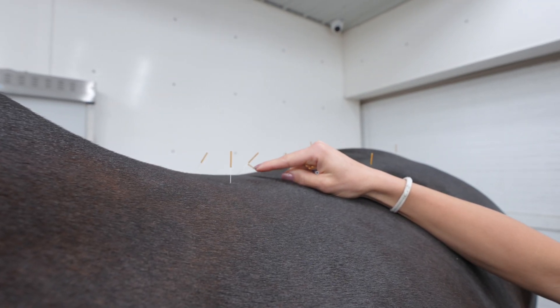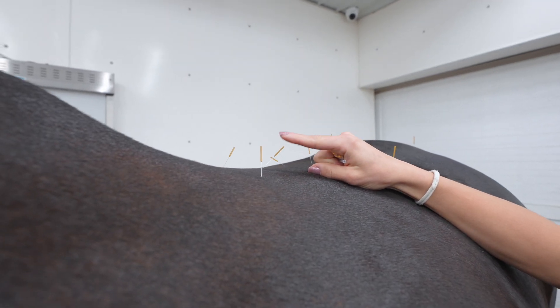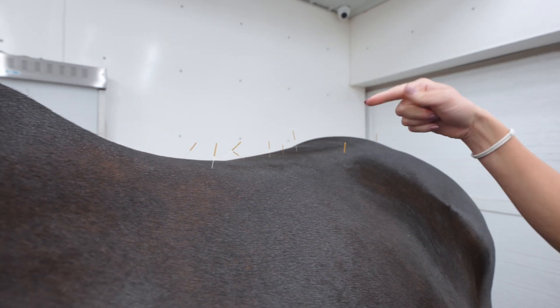As you can see, these needles are coming out slowly. That means the muscle on that region has relaxed. When the muscle starts relaxing, it starts pushing the needles out. So sometimes during the treatment the needles will fall out, but that means the treatment is working — the muscles are relaxing enough that they're pushing those needles outward. So that's a good sign.